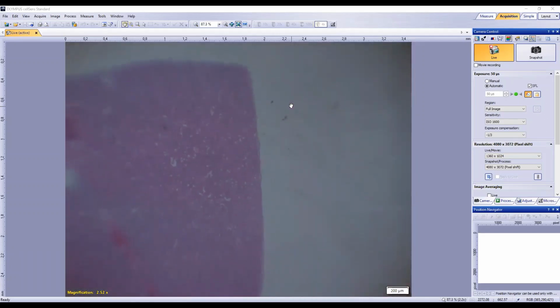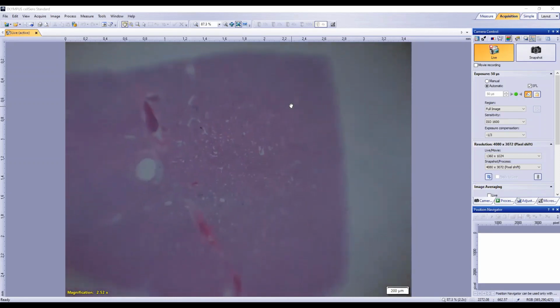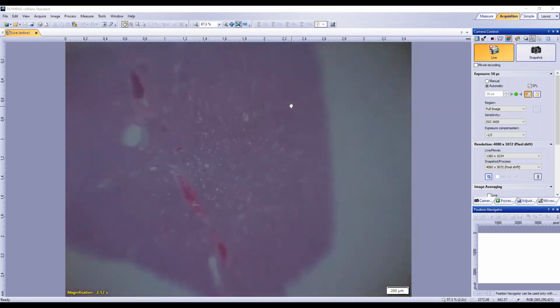So what can we tell about the pleura at this power? Well, I think it looks okay, basically. Yeah, like Pani said. So at the moment we've got a pneumonia, or we think it's likely to be a pneumonia because of the extent of consolidation.